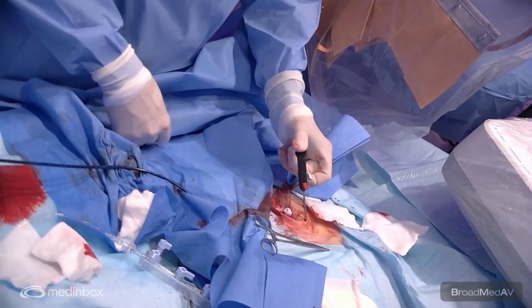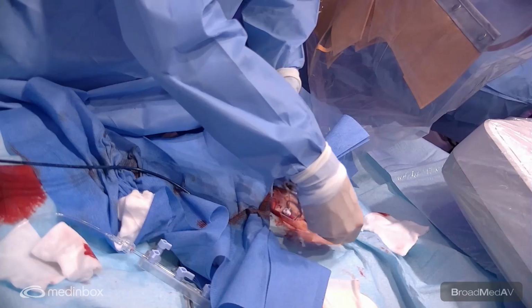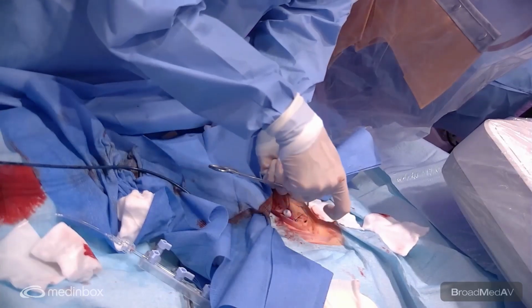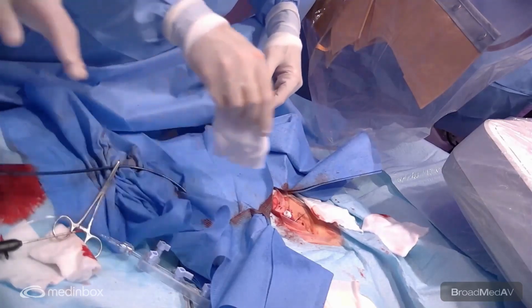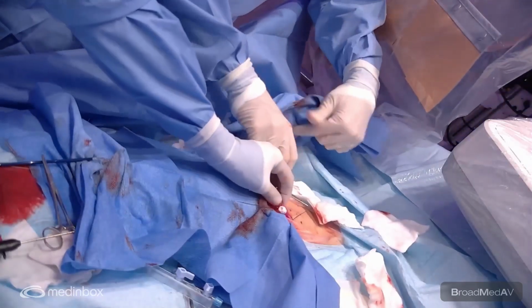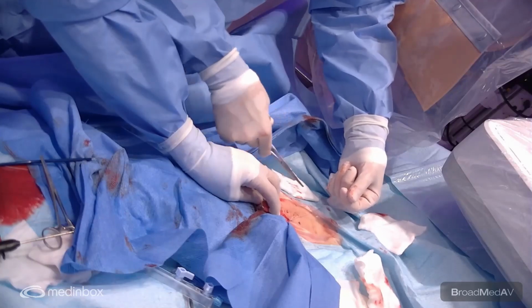He's having the knot pusher in place. And then when I'm confident, I just close the knot. So now you will pull on the other one to lock the knot. So the first suture is finished. It's closed and locked. Nice hemostasis. Yes, there's no bleeding at all. And now we will remove the other catheter.